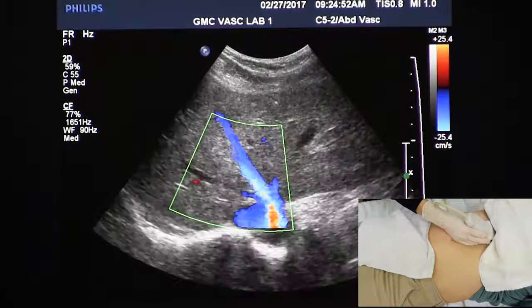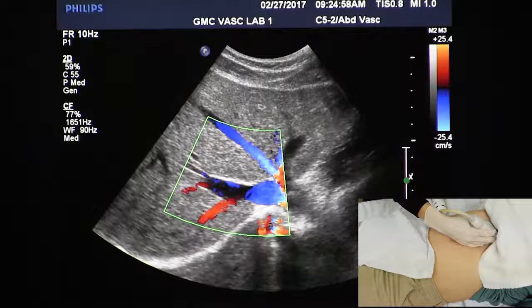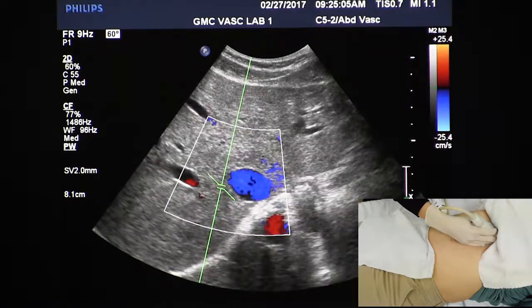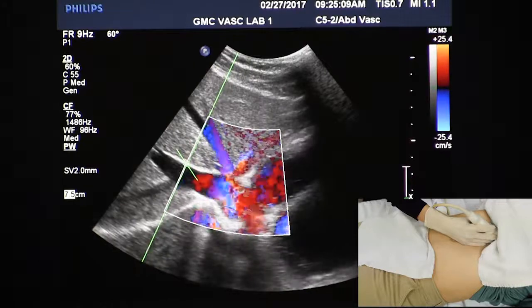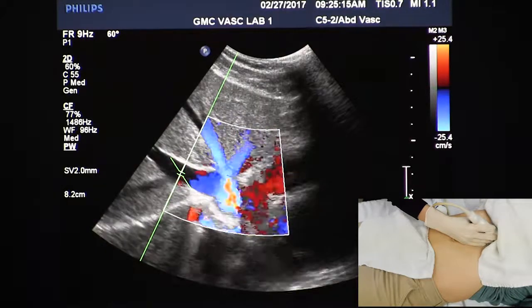Then we're going to go for our right. Okay, whenever you're ready, just stop breathing. Go ahead and breathe.